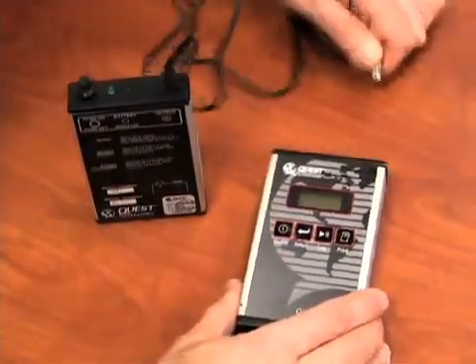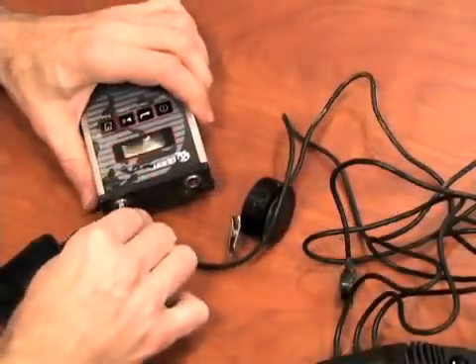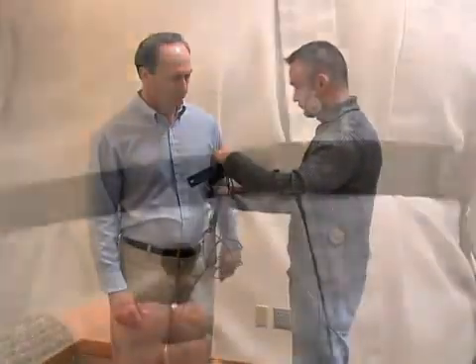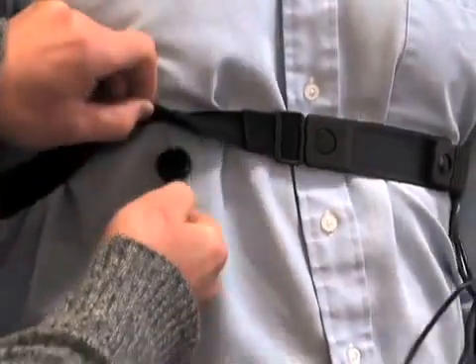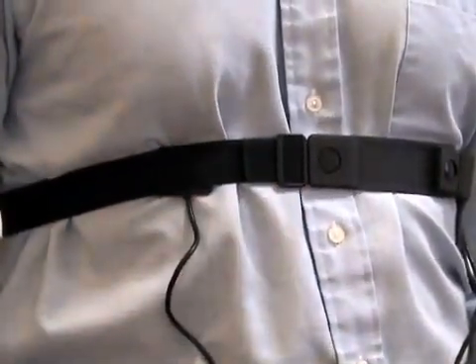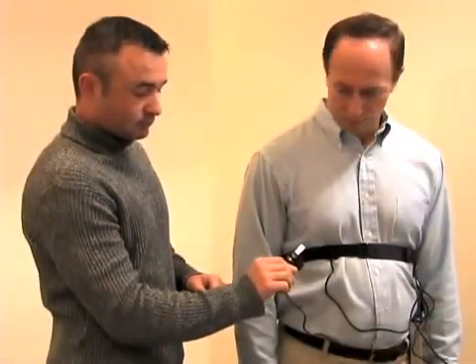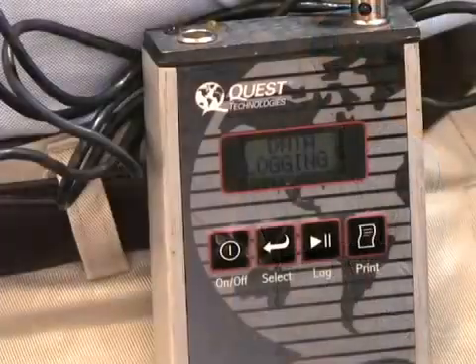Turn the unit on by pressing the on button. Connect the belt to the unit and place the sensor belt assembly on the person to be tested. The temperature sensor metal pad faces the person to be monitored and needs to be against the clothing and attached to the belt by velcro. The microphone sound alarm is to be attached to the worker's collar and will alarm if the temperature exceeds the alarm temperature setting.